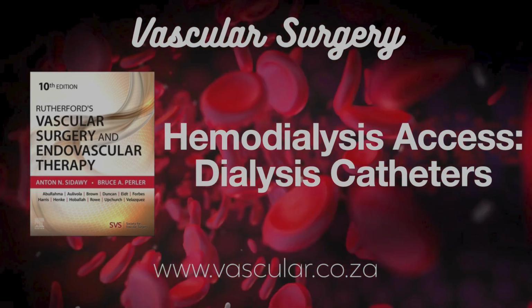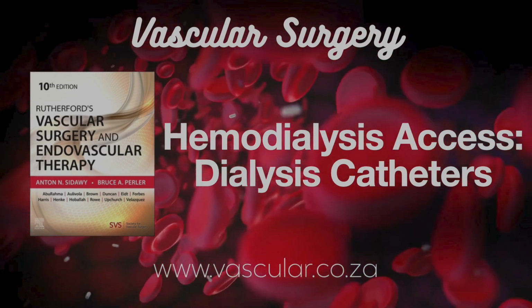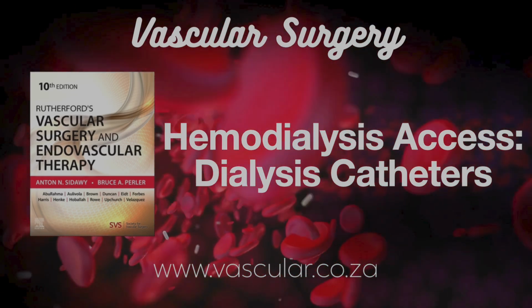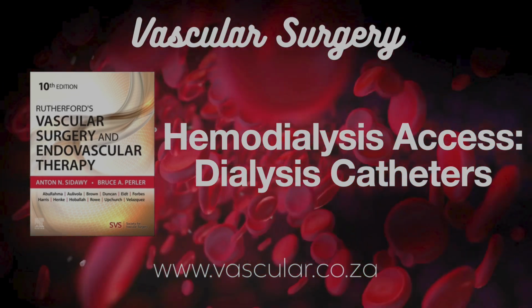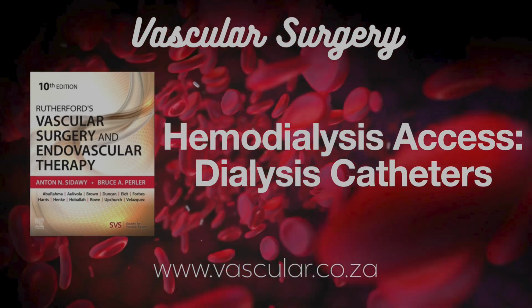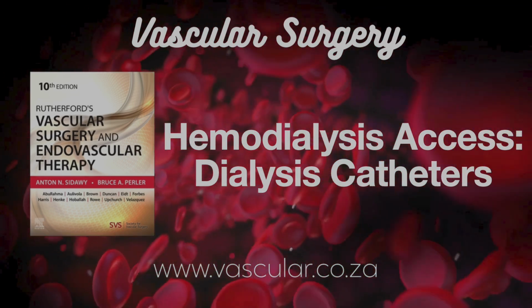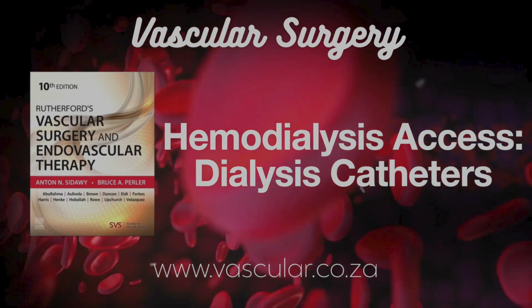That makes perfect sense. So look, everyone agrees AV fistulas and grafts are generally the best for the long haul, right? Oh, absolutely, the gold standard. But clearly, TDCs fill a critical gap. What are the main advantages they bring to the table? Well, several things. First, immediate use. You put it in, you can use it for dialysis straight away. No waiting for it to mature like an AV access. That's huge for someone needing urgent treatment.